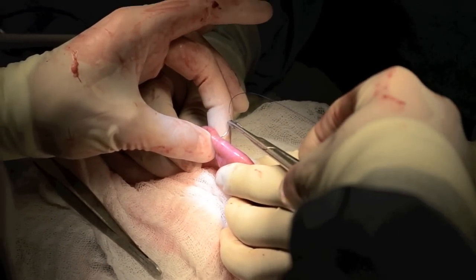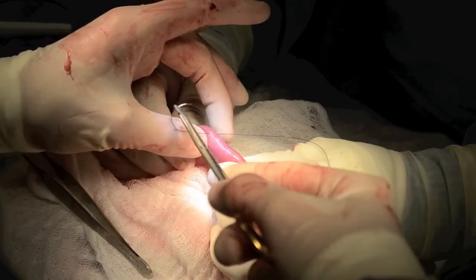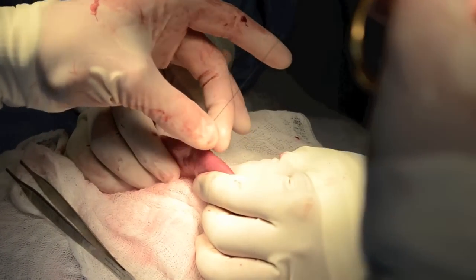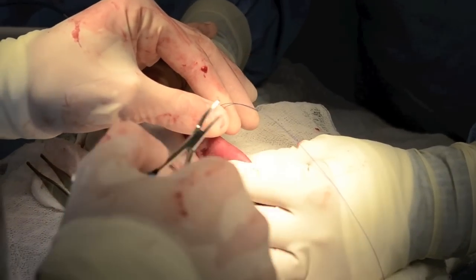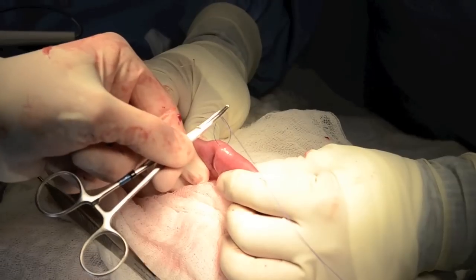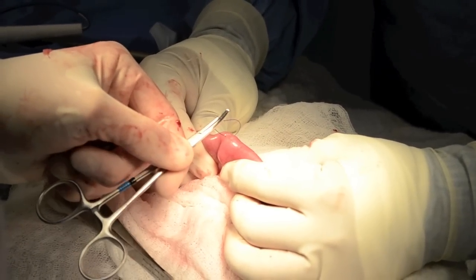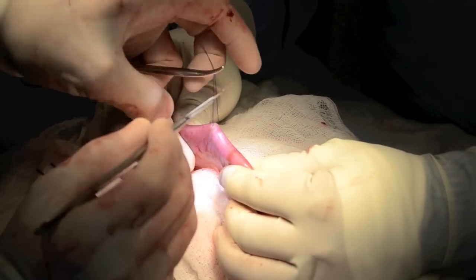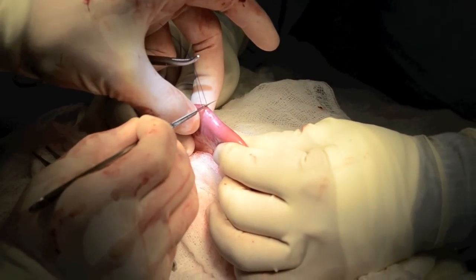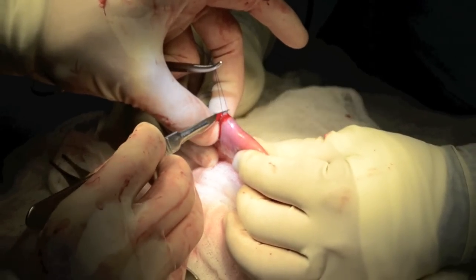Take as small a bite of the intestine as possible while fixing it either with the hands of the assistant or with a Doyen clamp. Using the suture to apply traction, use an 11 blade to take out the smallest possible wedge of intestine.